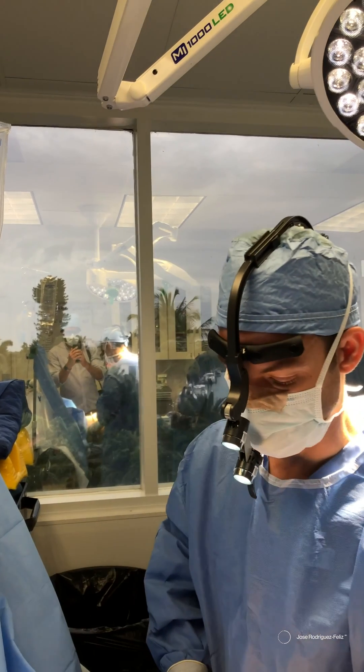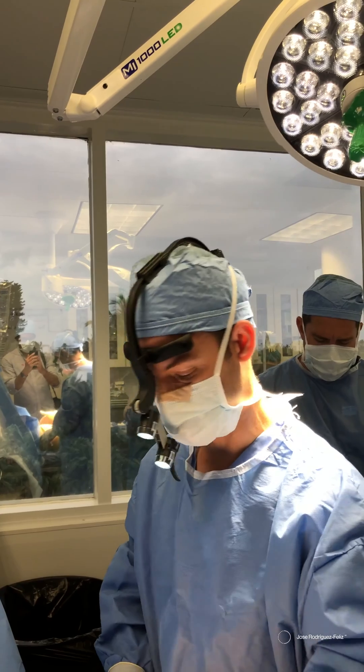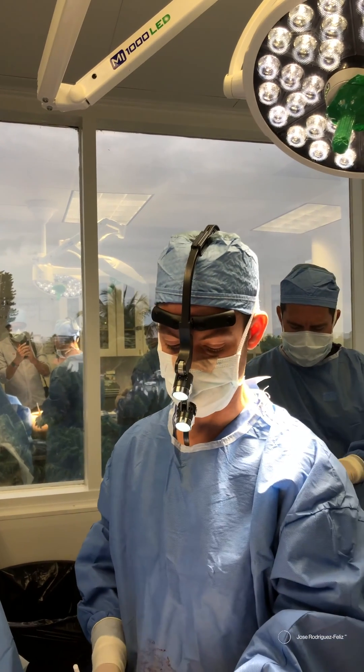In this particular patient, we did liposuction of the sides — the flanks — and also liposuction of the abdomen.